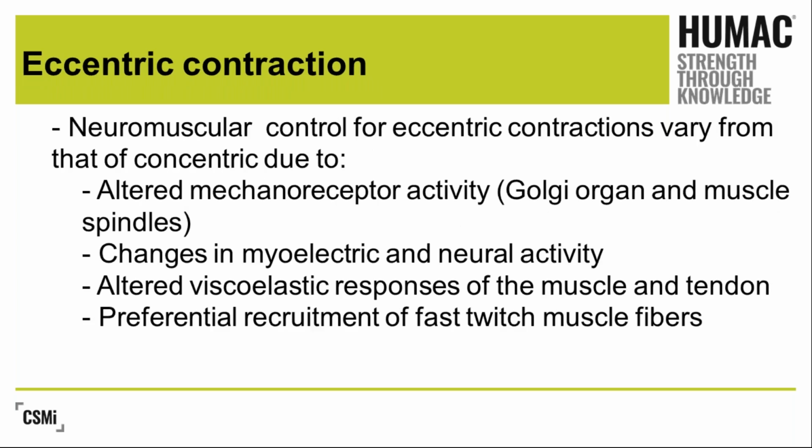But again, here's our problem. How many of our injuries actually occur in the eccentric mode? Neuromuscular control for eccentric contractions varies from that of concentric contractions. And we'll especially talk about this when we get into some of the neural adaptations that occur.